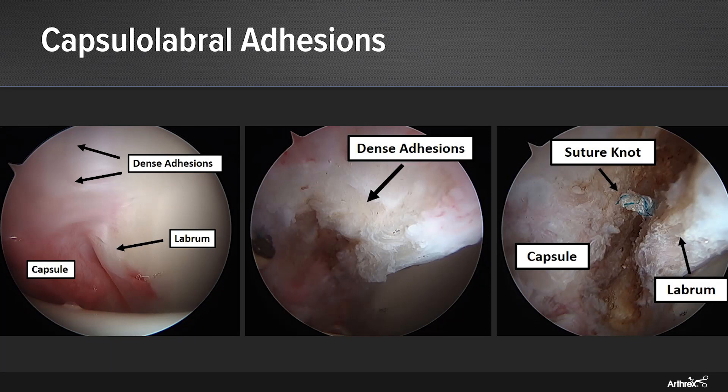After failure of extensive conservative treatments, this patient had continued debilitating hip pain that affected both her activities of daily living as well as her ability to work at her desired level. She therefore elected to undergo revision arthroscopic hip surgery.